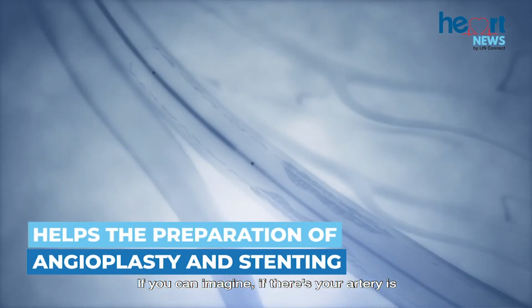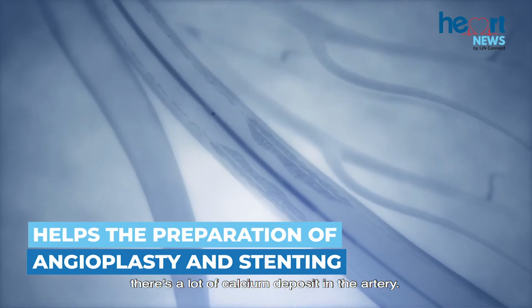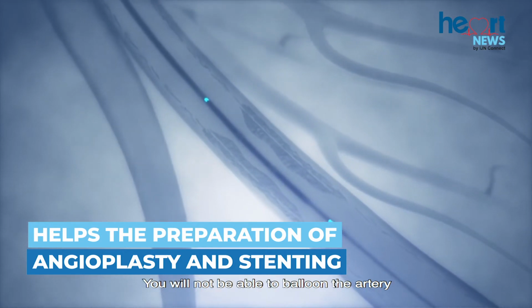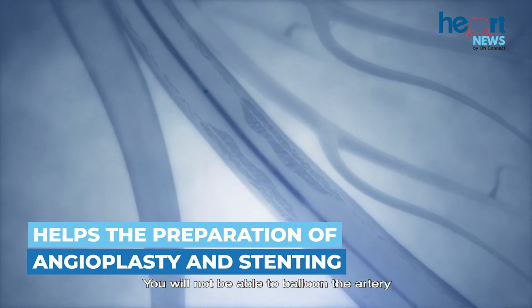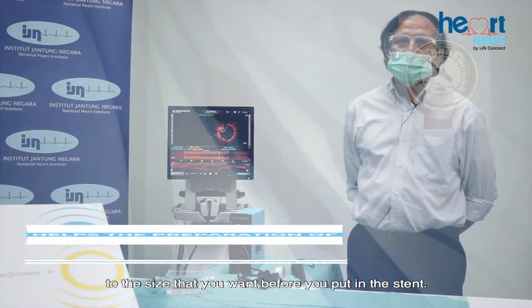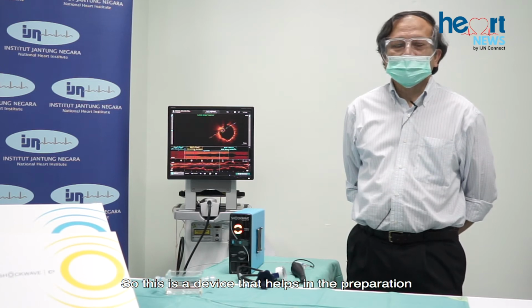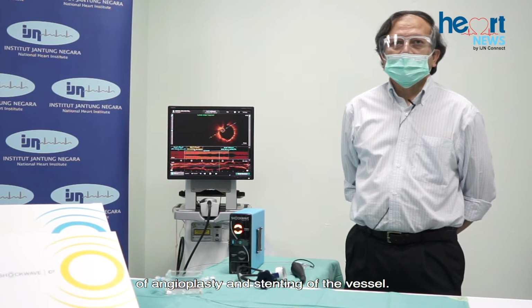If you can imagine, if there's a lot of calcium deposit in the artery, you will not be able to balloon the artery to the size that you want before you put in the stent. So this is a device that helps in the preparation of angioplasty and stenting of the vessel.